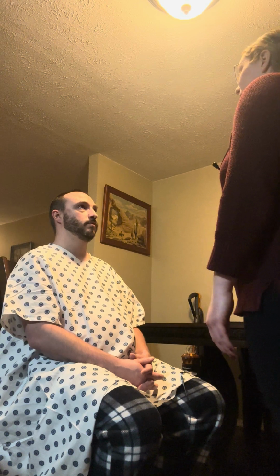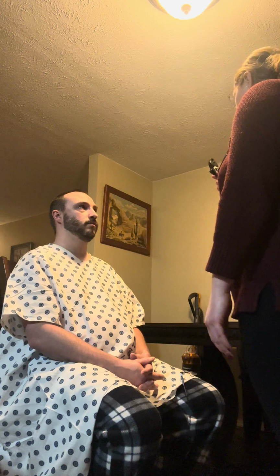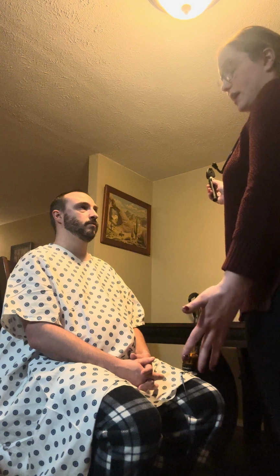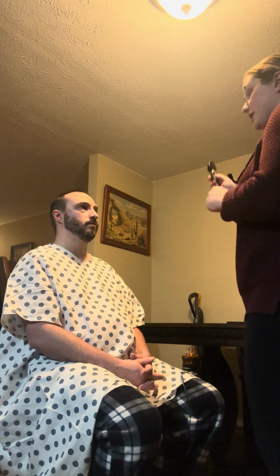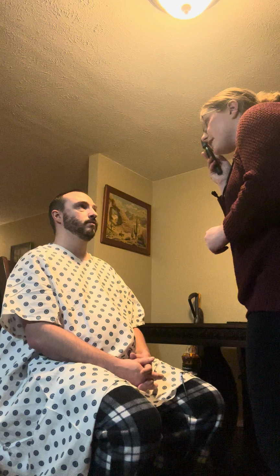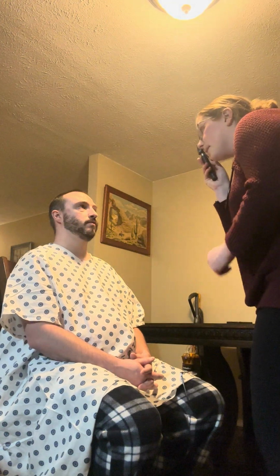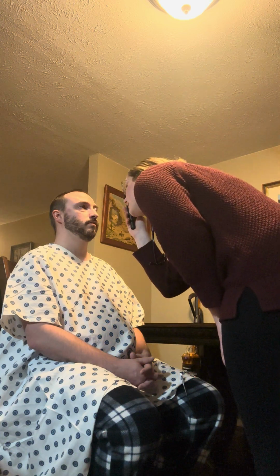And then I'm going to look in to identify the red reflex. For this, I have the ophthalmoscope on 0 because I do have 20/20 vision with my glasses. So for his right eye, I'm going to use my right eye to examine. And I actually do see the optic fundus, or the red, and I'm going to go in and visualize the inner parts of his eye.